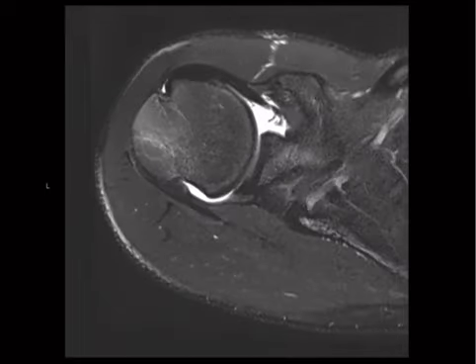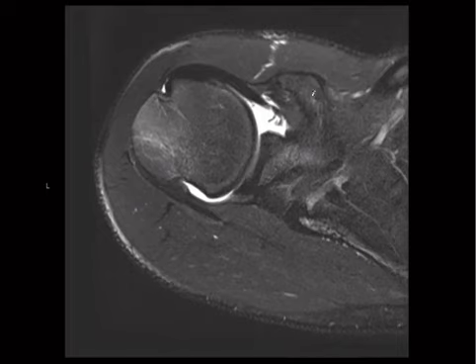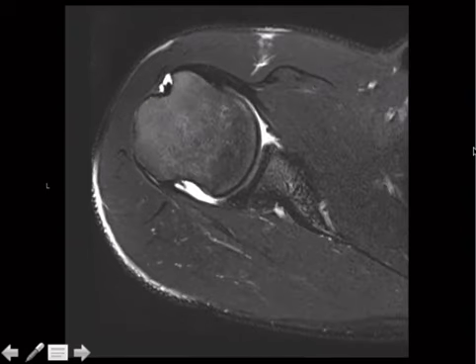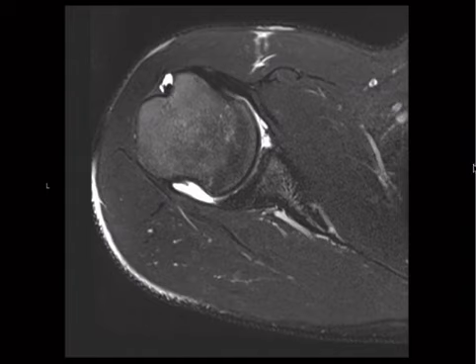Going down, eyes on. So here's the coracoid process, right? So that's how we know we're anterior. That thing is anterior. What tendon is that? Probably subscapularis, right? Because that's the one that's anterior. Moving across, biceps tendon. Alright, so pay attention to this right here. So we're now anterior, inferior.